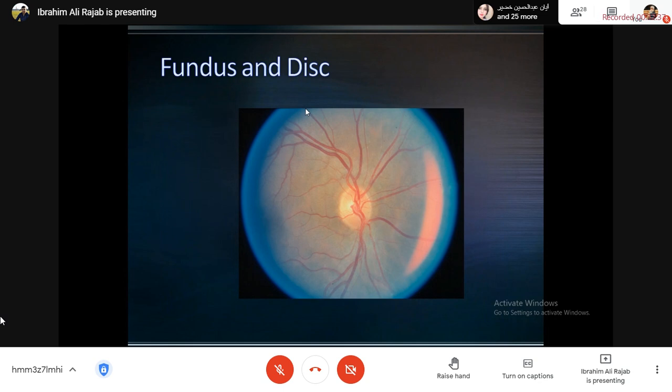Yes, doctor. Amna Issa. Amna, describe this image please for me. Normal fundus with a clear demarcation of... Okay, no. This is an image of the fundus, and you start with the disc. So you have a system and go on. With a clear demarcated optic disc.